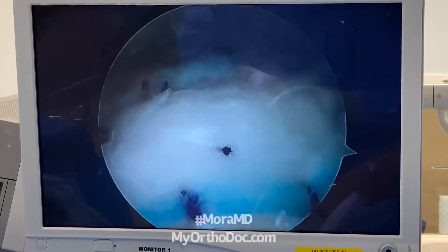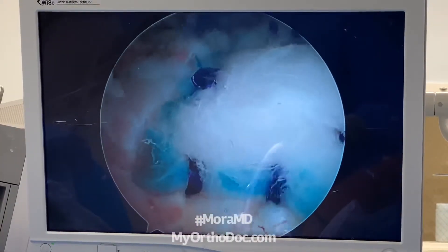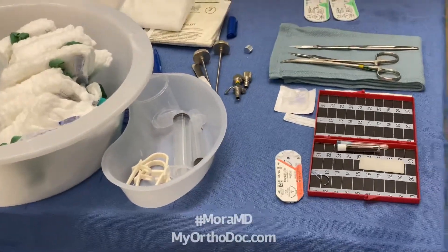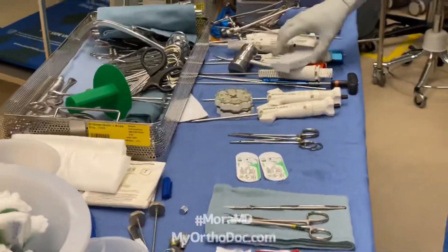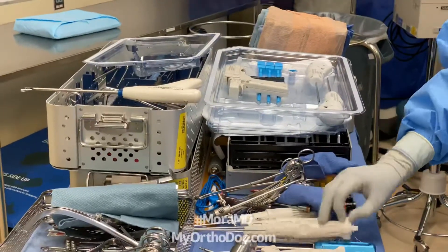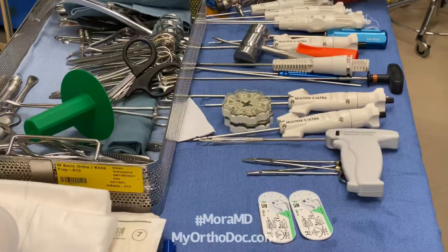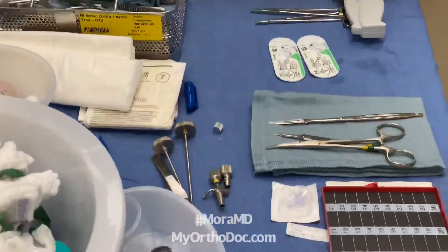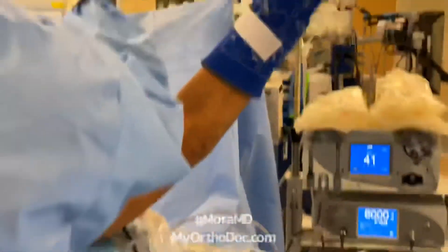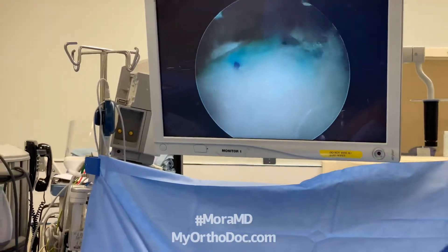What will happen over time is there will be vascularization of this patch and it will become part of the tendon. Once again, Dr. Moore showing you a revision rotator cuff repair — a very complex case which requires a lot of resources. Multiple anchors of all different types: Smith and Nephew multi-fix lateral anchors, Stryker Speed triple-loaded tape anchors, Q-Fix anchors for the medial row. Each anchor is probably about $450–$500, and this graft is thousands of dollars. A lot of resources and expertise and human power is required to do a revision. This includes our type of anesthesia and nerve block — Dr. Moore showing you Morat cutting-edge orthopedic surgery.